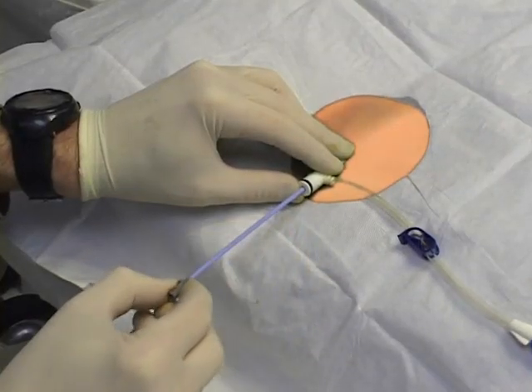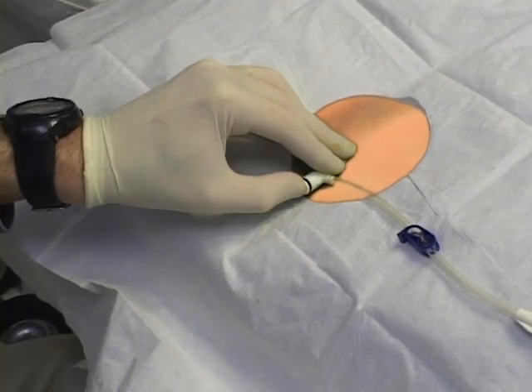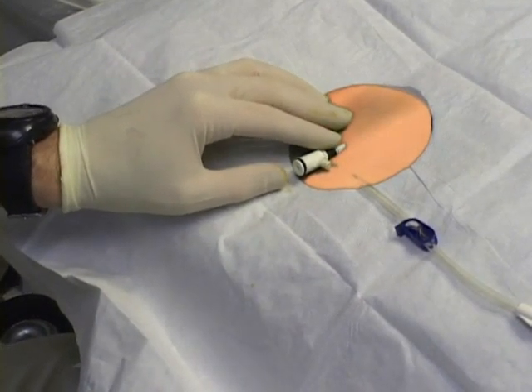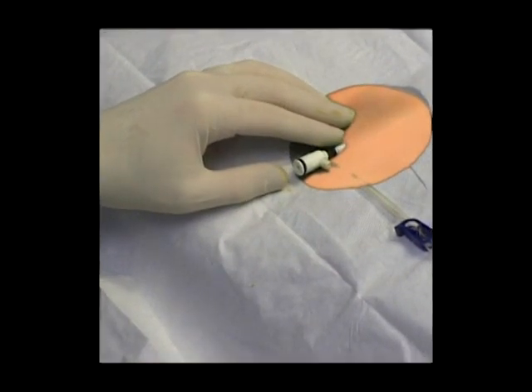Connect the catheter hub to an IV set and obtain a chest X-ray to confirm placement and ensure no harm was caused to the lung on that side.